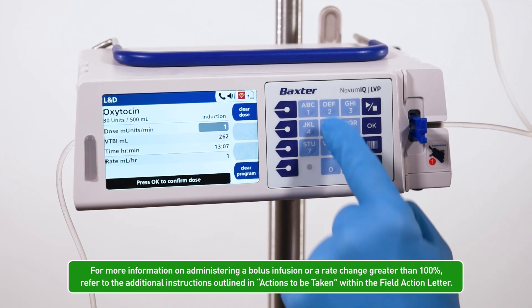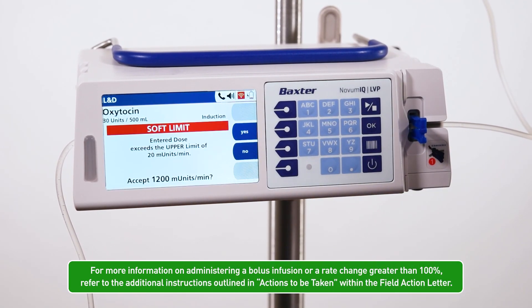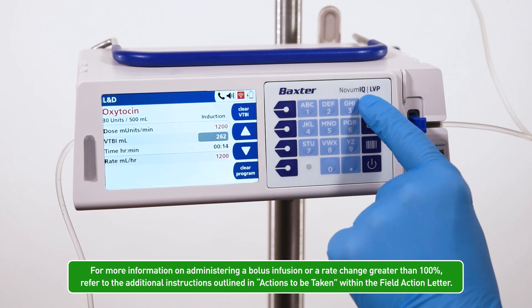For more information on administering a bolus infusion or a rate change greater than 100%, refer to the additional instructions outlined in the Actions to be Taken within the Field Action Letter.